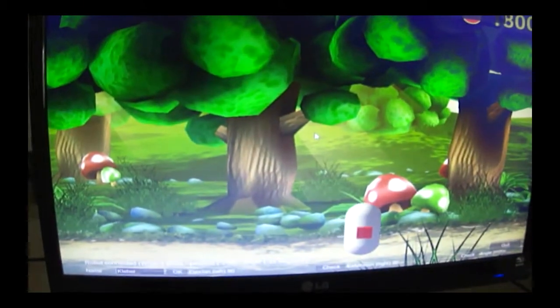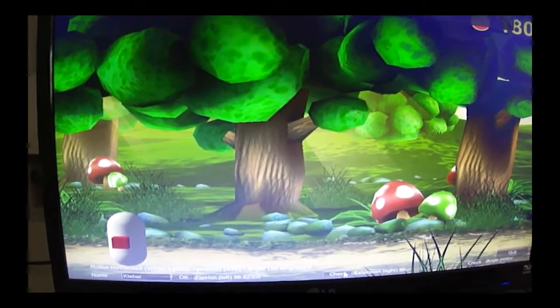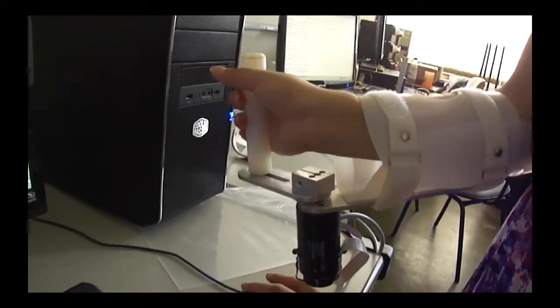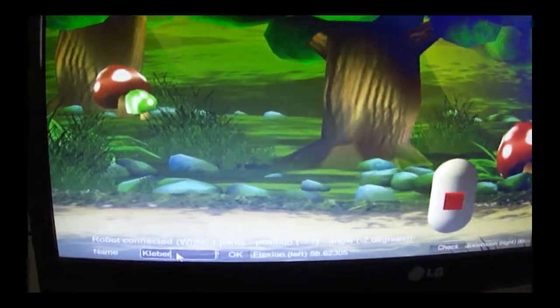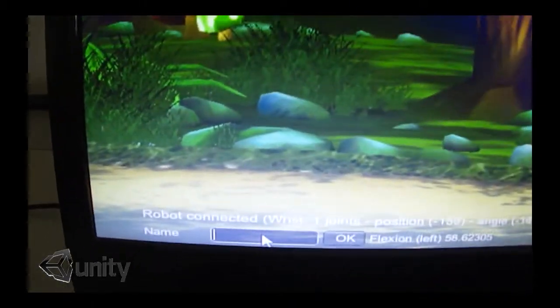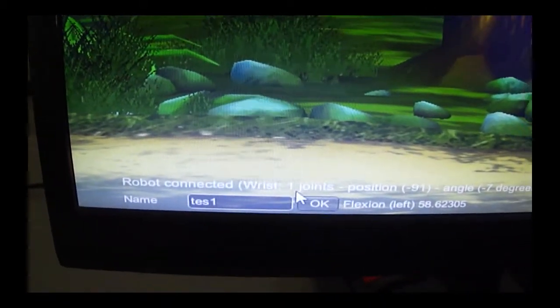The game interacts with the patient by displaying the game screen and showing if he is hitting or missing, and where he has to go. At the beginning, the game calibrates the maximum range from the patient's wrist movement. This is the Catcher, a game developed in Unity, where the fox has to catch the nuts that are falling in different speeds and frequencies.